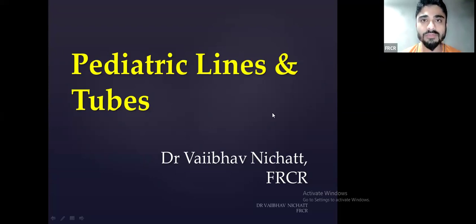Pediatric lines and tubes are important because many a times in the examiner's notes, they have mentioned that candidates are not very familiar with pediatric imaging, including pediatric lines and tubes. So in order to identify which line is placed, what is the exact position of the line, and whether there are any complications associated with the particular line and tubes in the pediatric age group, you should know about that. Okay. So that was the overall background for why we are going to learn about pediatric lines and tubes.